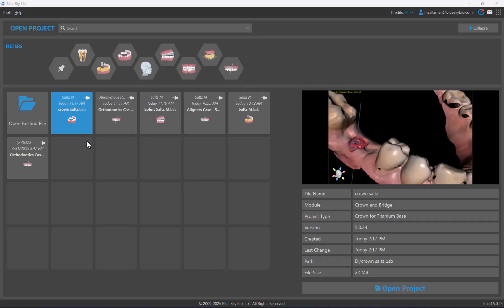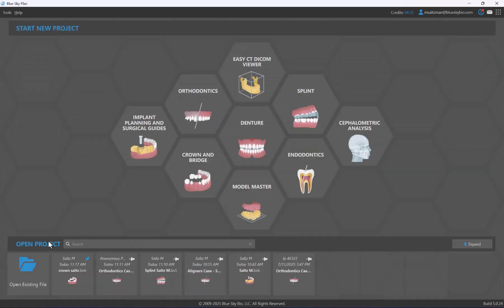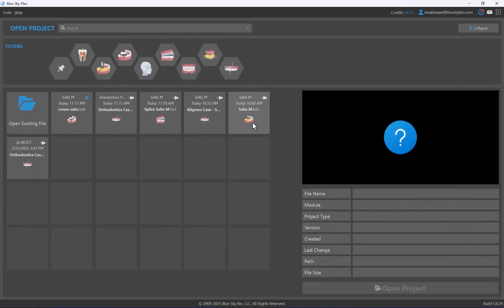You could click open project to launch the relevant project. To pin a particular project to its spot, simply click on the pin and it will stay in its location even if other recent projects appear. This works whether you've expanded the open project section or it's collapsed.